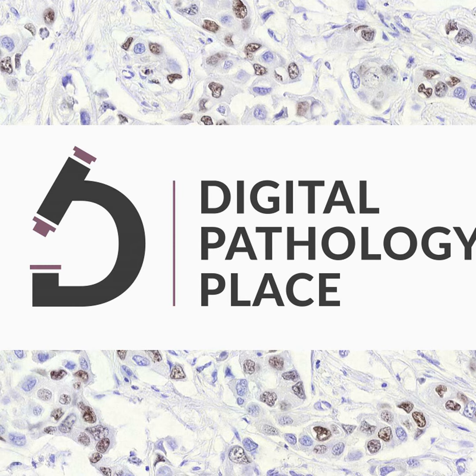And that would take about an afternoon, we'll say, with 30 slides. Now, when we start going and downloading TCGA data, it's more noisy than slides that were made specifically for computational study, while at the same time, you have thousands of slides. So it's no longer possible for me to go and say, I'm going to open up 5,000 slides and quality control all of them and manually go and identify where the blurry regions are or where the cracks are. It's just not feasible anymore.